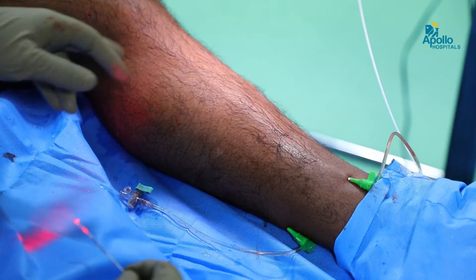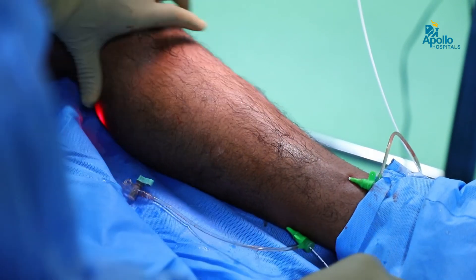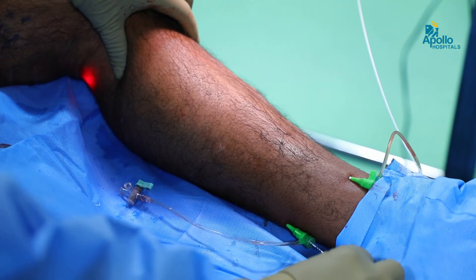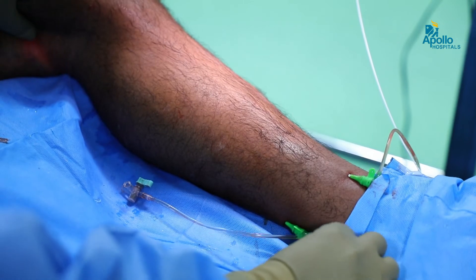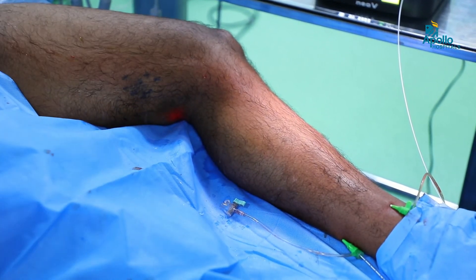Now the great saphenous vein is ablated almost up to the knee length, and next the short saphenous vein will be treated. You can see the short saphenous vein being cannulated, the fiber being passed, and we can see the laser fiber going up to the saphenopopliteal junction. The laser fiber is passed to the short saphenous vein and we confirm this junction under ultrasound guidance, and then we will start burning.